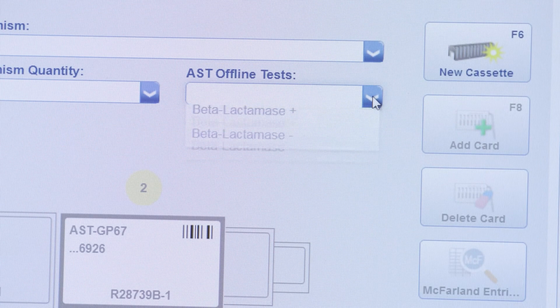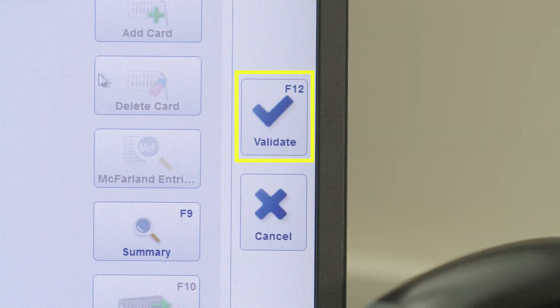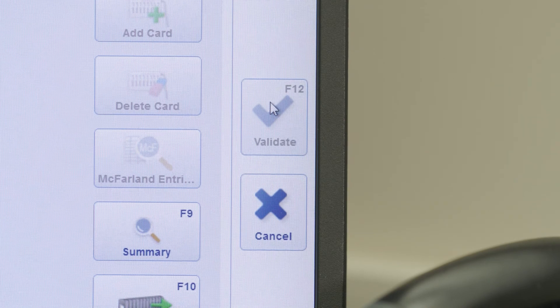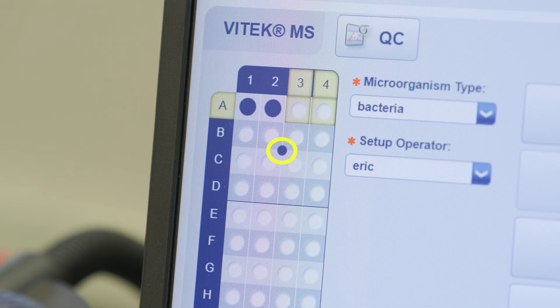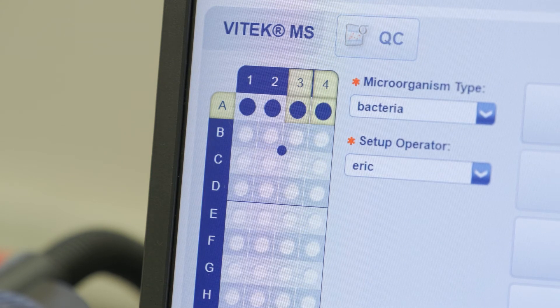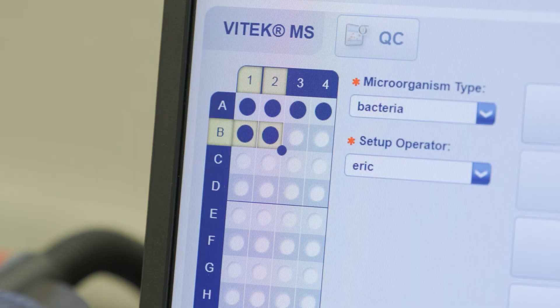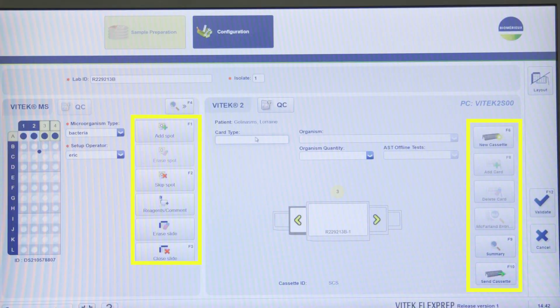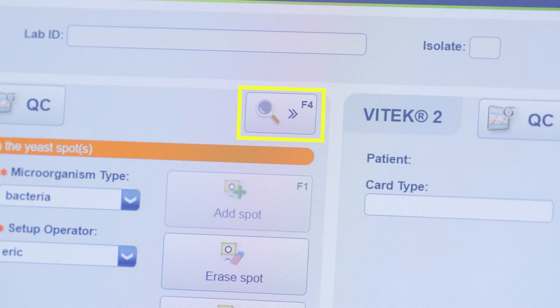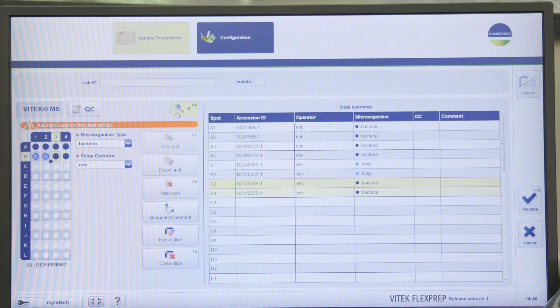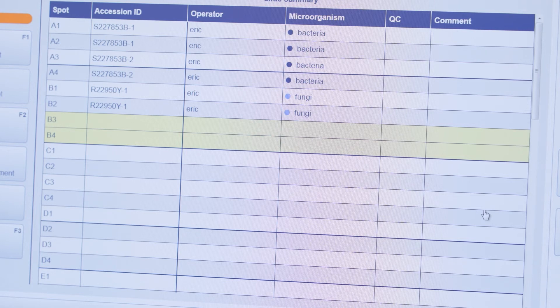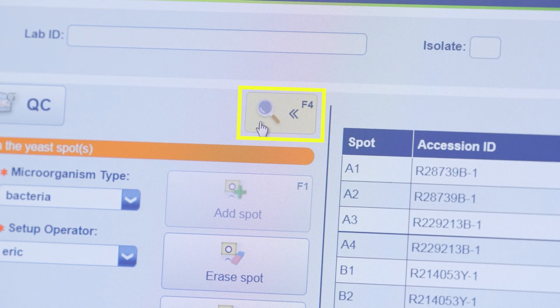Enter offline test information if applicable. Click Validate to complete data entry for each isolate. Once the first sample spot is identified, the Vitec FlexPrep software indicates the calibration spot of this acquisition group as filled automatically. Perform the previous steps as needed for additional isolates. Adding or deleting spots or cards and other functions can be performed as needed using the additional action buttons. Click the Slide Summary icon to display the Slide Summary, which can be checked to verify accuracy before closing the slide. Click the Slide Summary icon again when finished.